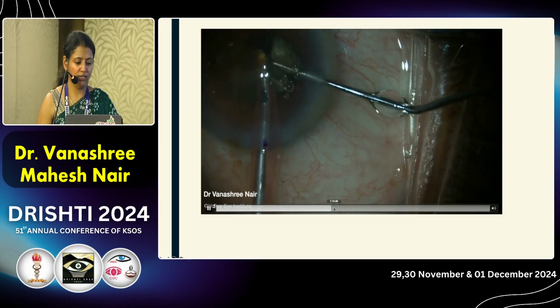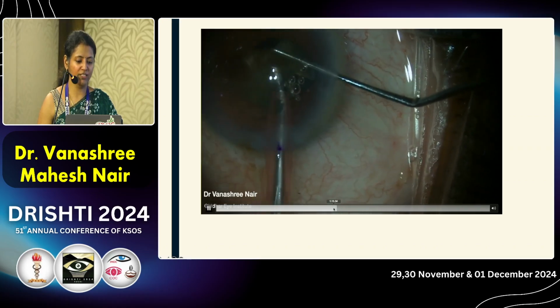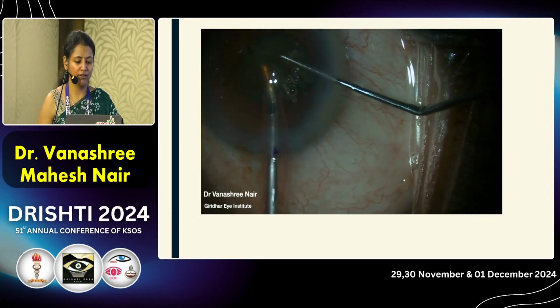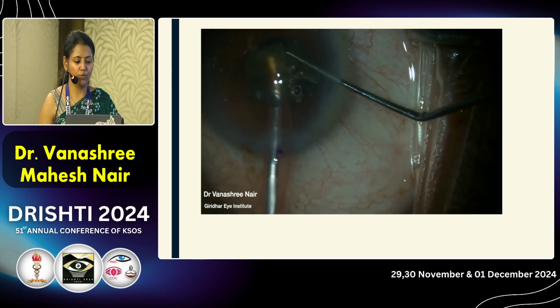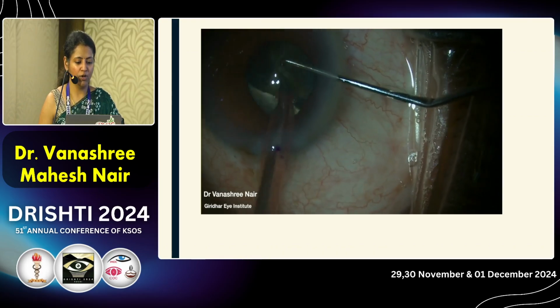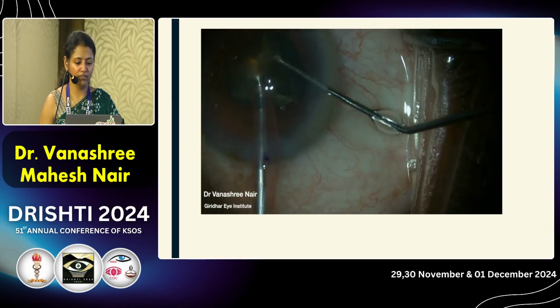I'll speed up a little because here you can see that the iris has started coming to the side port. A little bit of iris is coming and trying to plug the side port, but I continue. It is not a very leaky wound, so I know that it is going to be okay.